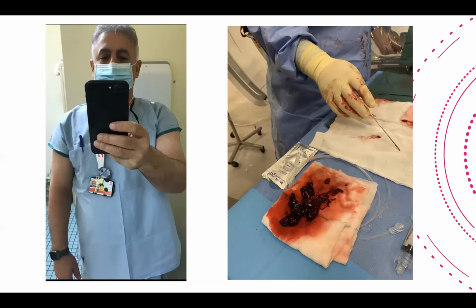Sorry for the picture, but this picture had been taken at 4 a.m. when I was on call. I've been called to deal with a young gentleman with submassive pulmonary embolism, background of a complex spine and brain surgery, and they don't have any options. They called me, can you offer something?